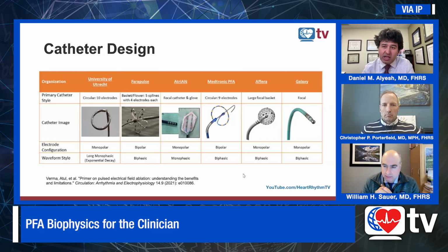Although time will tell what that looks like. And people are trying to figure out in the AFib world how to do this under sedation. And that's kind of one of the limitations that we're seeing. I just did, as of about 20 minutes ago, a procedure with conscious sedation with the pentaspline catheter. I don't recommend it.